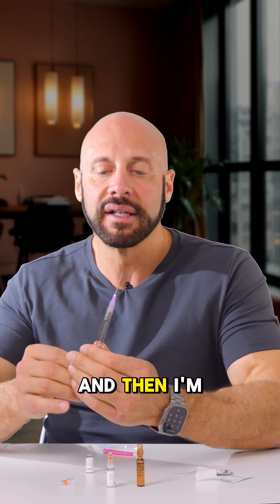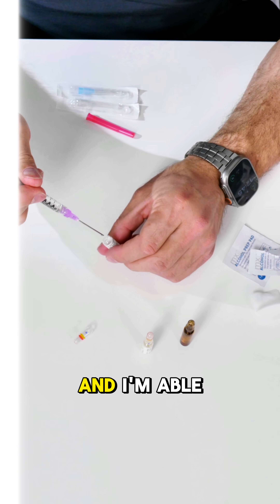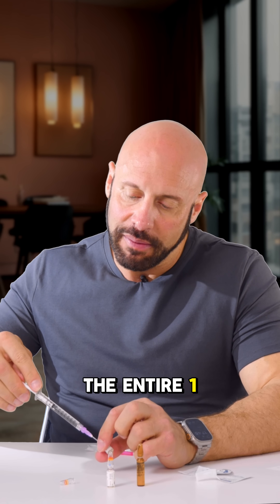Then push up and flick that over. Go back into the syringe, and you're able to get out the entire 1ml.